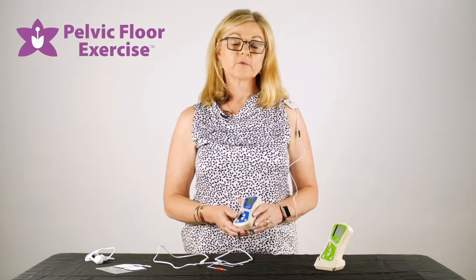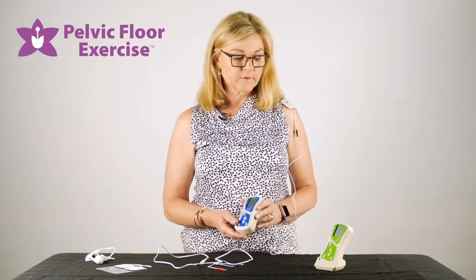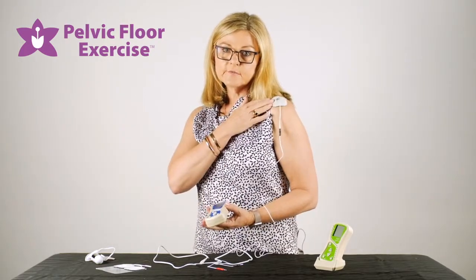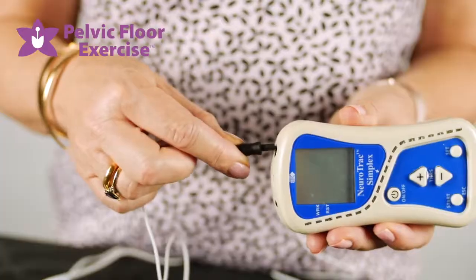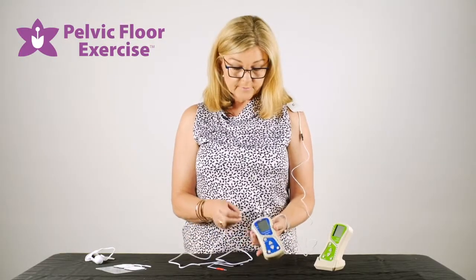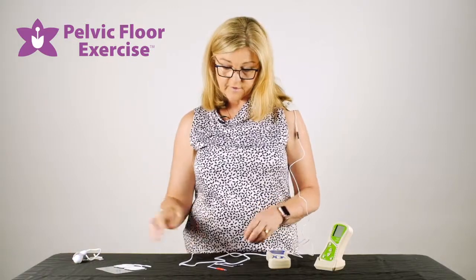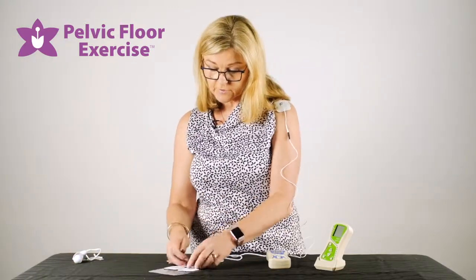Hi, I'm Fiona the physio from pelvicfloorexercise.com.au, and today we're going to have a look at the EMG machines, the Peritone and the Simplex. For ease of purpose, I've started with my lead reference attached to a bony prominence on my shoulder, and that attaches into the left side of your machine. If we're using the machine for pelvic floor rehab we would tend to use a vaginal or an anal probe, however so that I can demonstrate I'm going to use some surface electrodes on my arm.